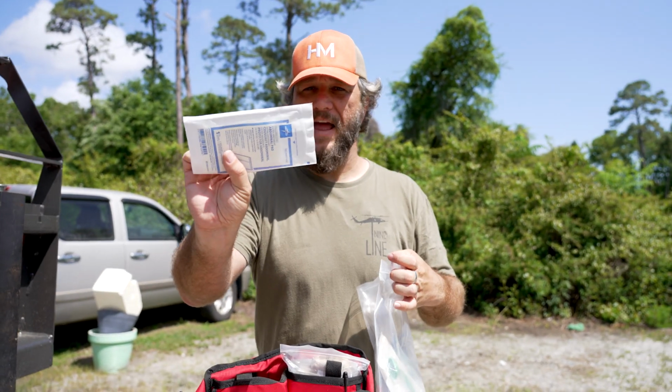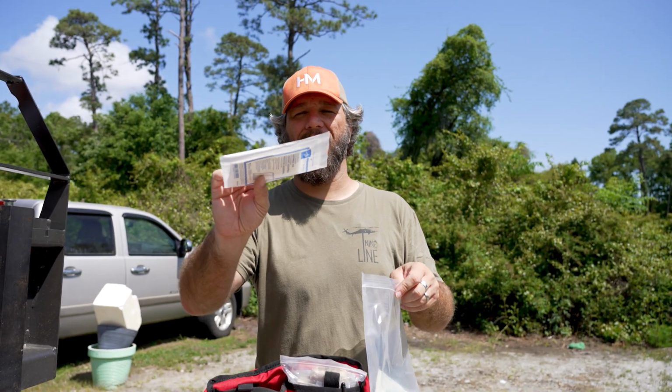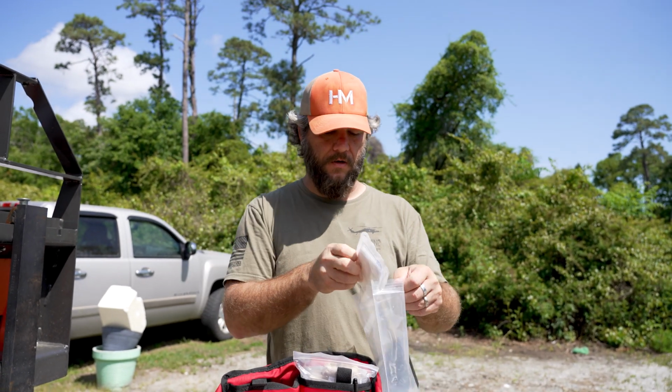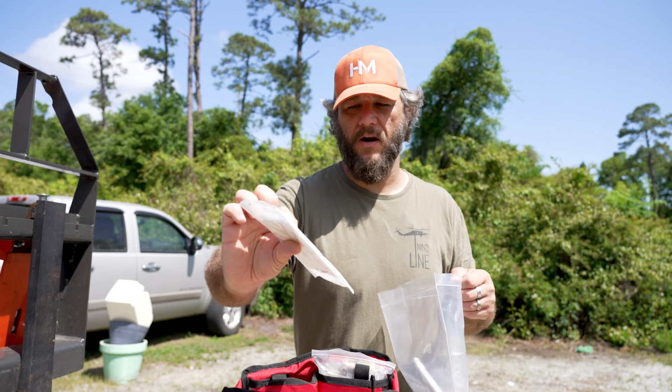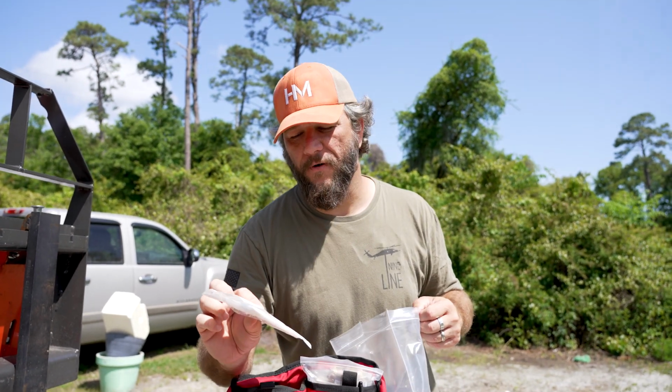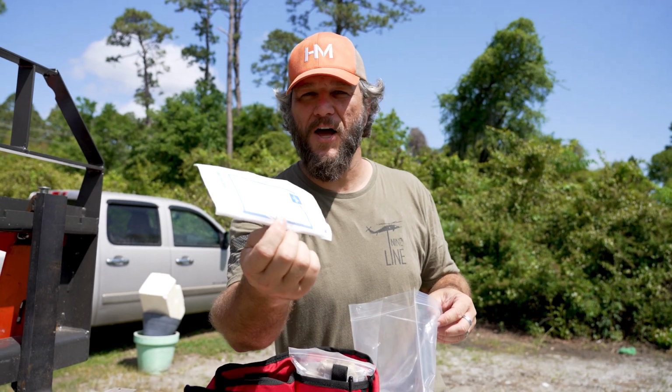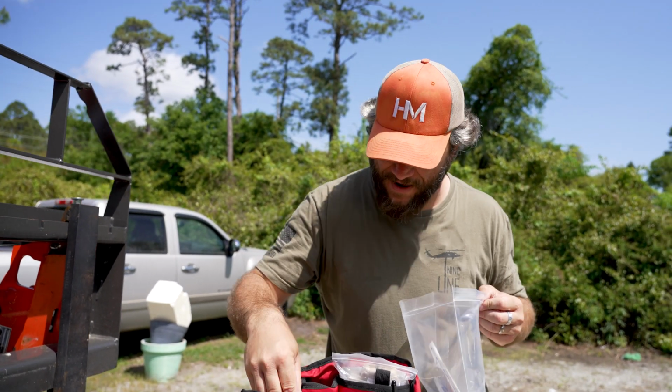And an abdominal pad. This would just be, if you did want to wipe off before you put the chest seals on, you could use this. Another abdominal. It's the abominable snowman. This is an abdominal pad, another one that's in that bag.